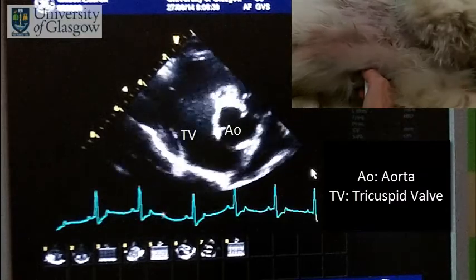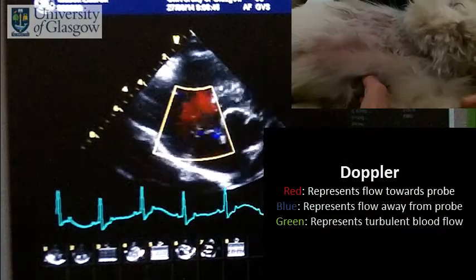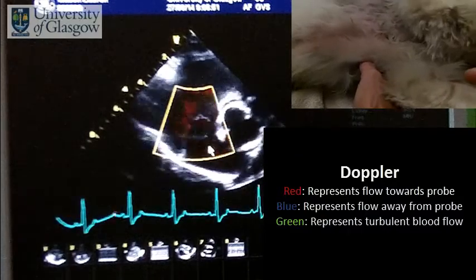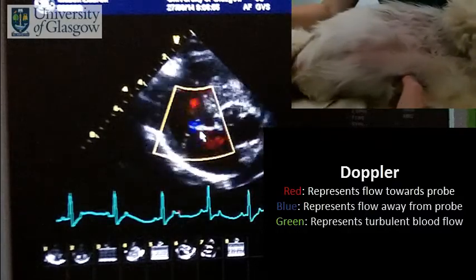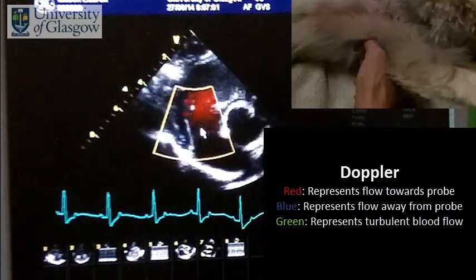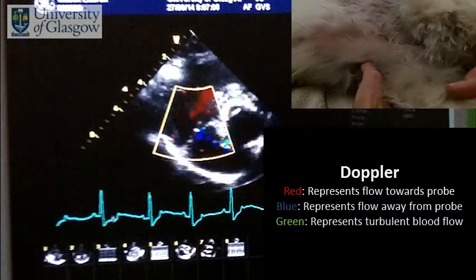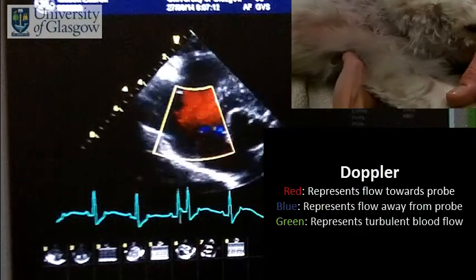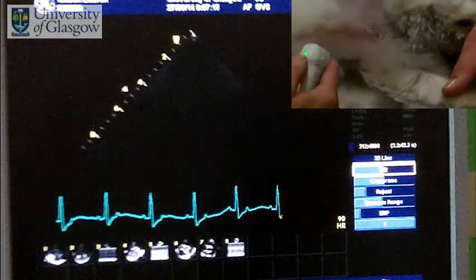Focusing on the tricuspid valve, we can look again to see if there's any evidence of abnormal flow. We can see the red flow, which is the flow going towards the probe from the right atrium to the right ventricle, but again we can see a little tiny jet of turbulent blood flow here across the tricuspid valve — a very small insufficiency of the tricuspid valve.